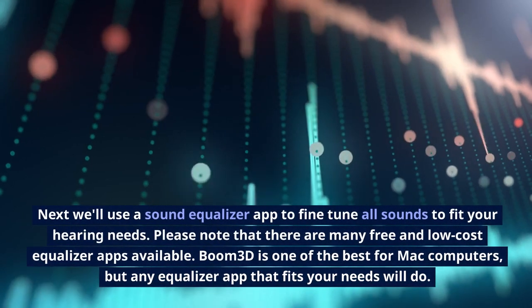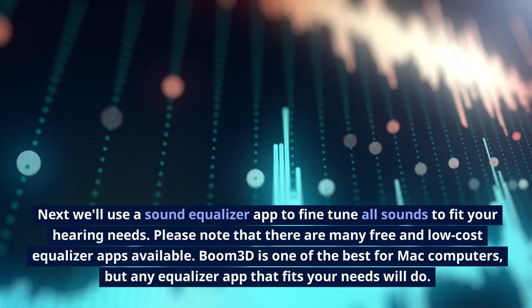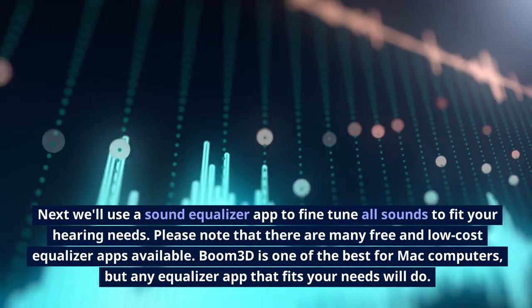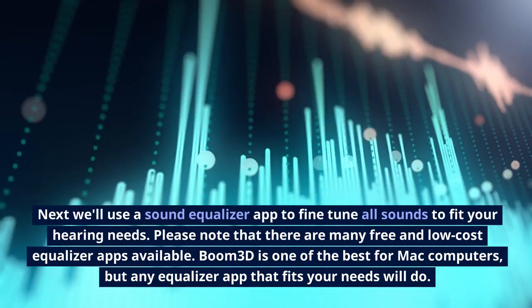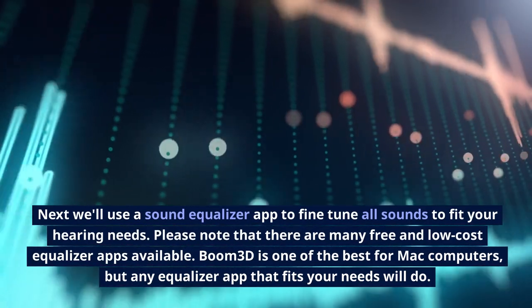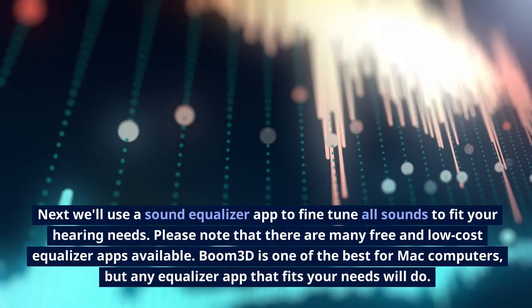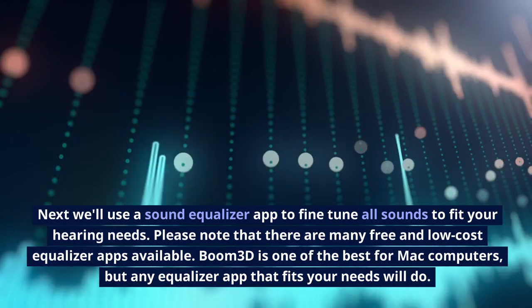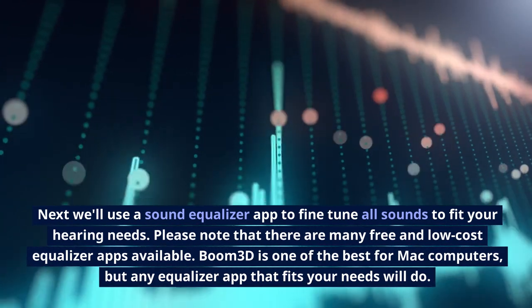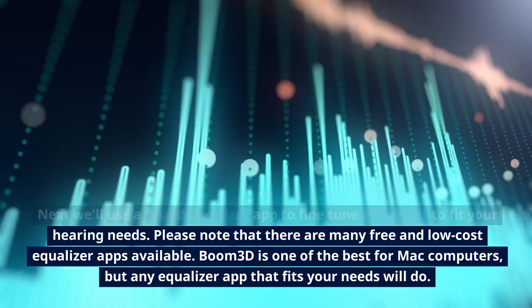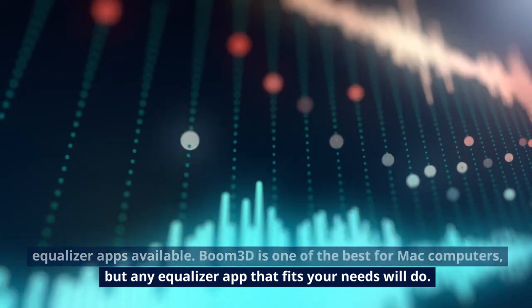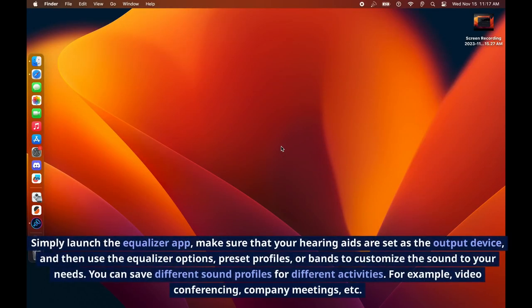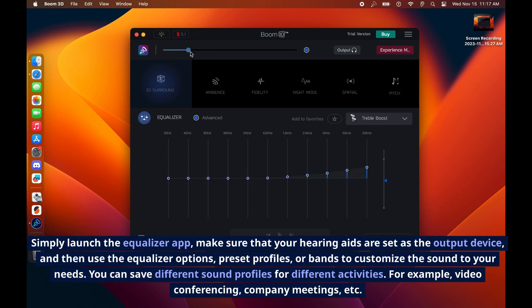Next, we'll use a sound equalizer app to fine-tune all sounds to fit your hearing needs. Please note that there are many free and low-cost equalizer apps available. Boom 3D is one of the best for Mac computers, but any equalizer app that fits your needs will do. Simply launch the equalizer app, make sure that your hearing aids are set as the output device, and then use the equalizer options, preset profiles, or bands to customize the sound to your needs.